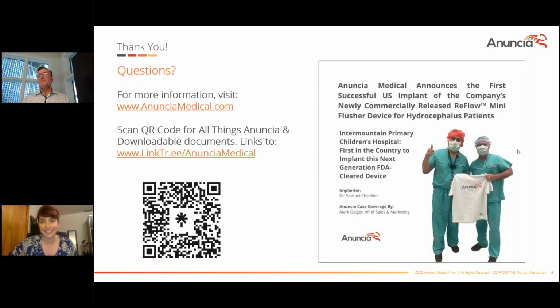That's a great question. Thank you. So you're trying to use the geometry of the shunt system, and that is the inner diameter of the ventricular catheter. That's all fluid filled in a hydrocephalus shunt, and the amount of pressure that can be generated by depressing the ReFlow. And I'll point out that you have to press the ReFlow with a finger or a thumb with the right amount of force in the right direction to get it to actuate. So for example, it would be nearly impossible to actuate the device by laying your head on a pillow, or even if you had something flat depressing on your head. It has to be pressing in the middle of the flusher with just the right amount of force to actuate the system.